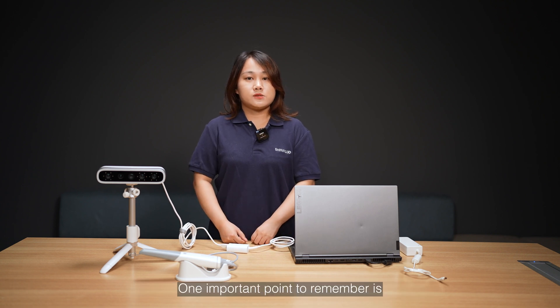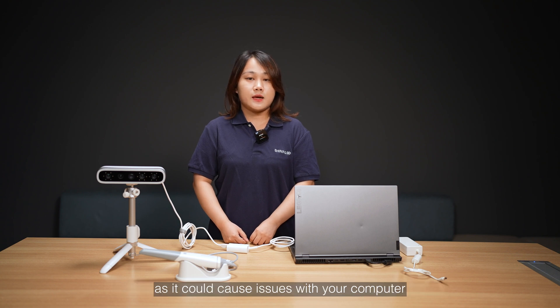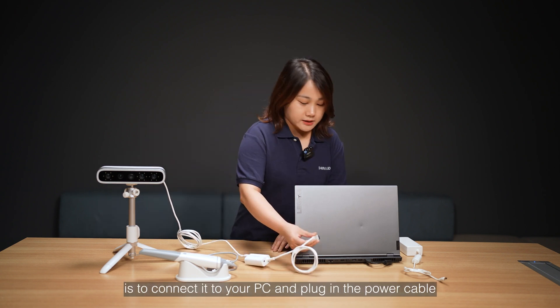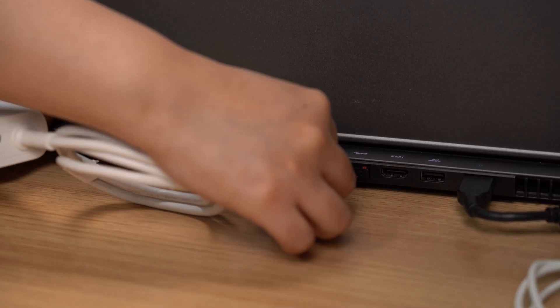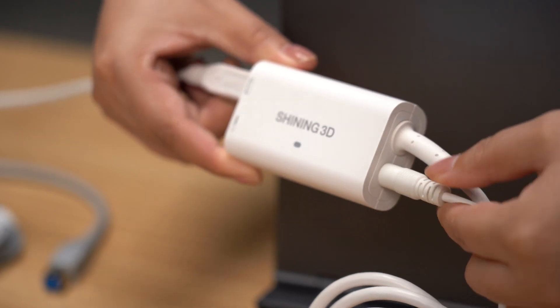One important point to remember is not to connect the Matti Smile with the OroScan3 wireless, as it could cause issues with your computer. The final step for setting up the Matti Smile is to connect to the PC and plug in the power cable. Great, that's all set up.